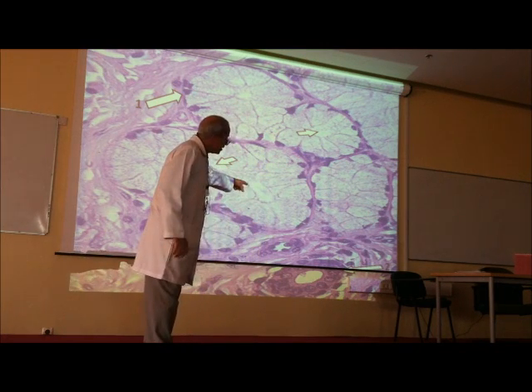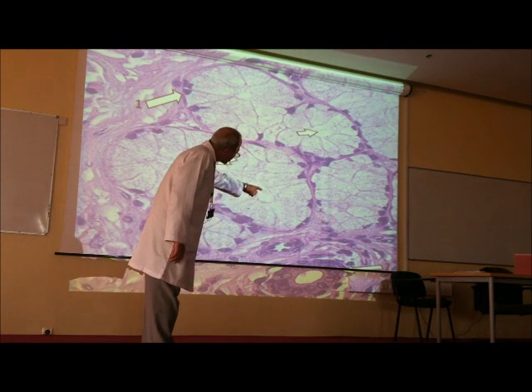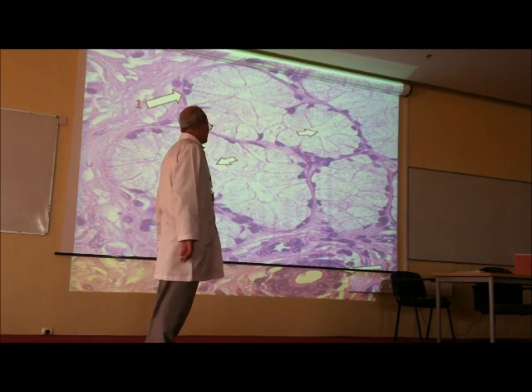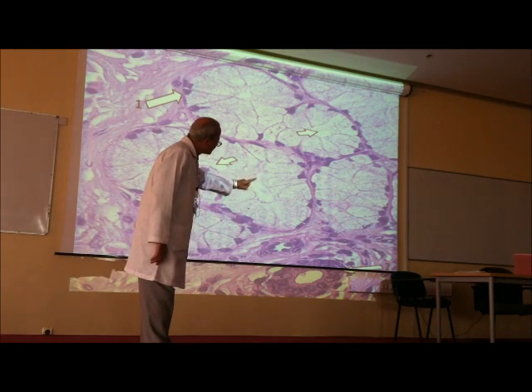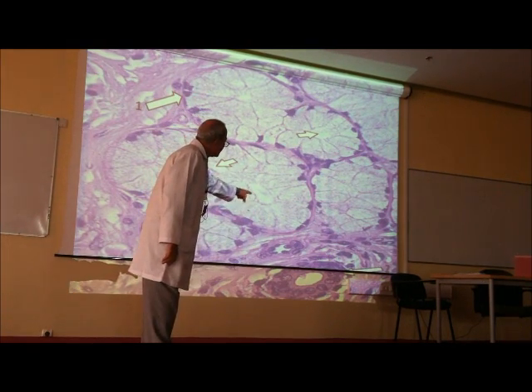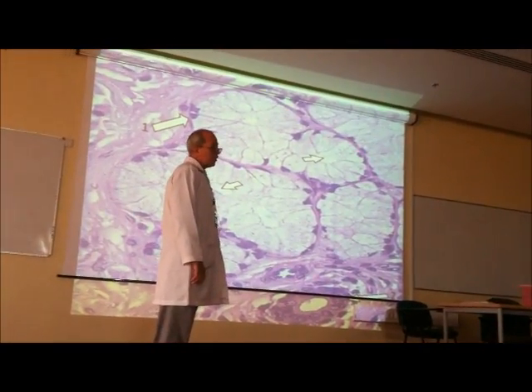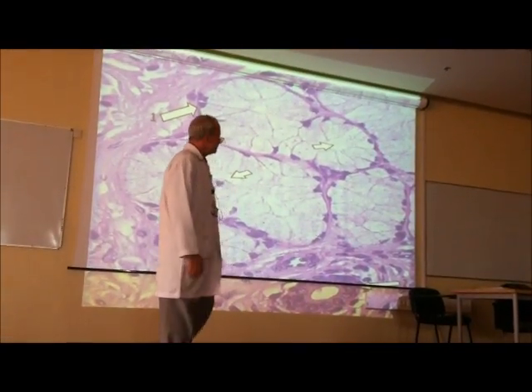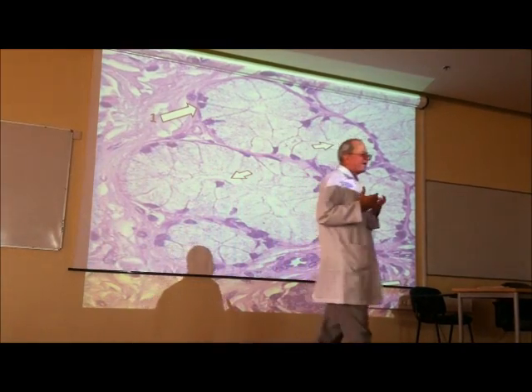Actually, this is a duct lined by simple cuboidal epithelium. The nuclei are found in the middle of cells, and the cell boundary here is clear. Okay? If we change the picture, we make you think.